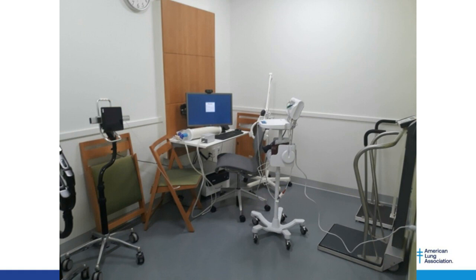I want you to notice how close the two chairs are next to each other. We have the calibration syringe and a spirometer on the table there, along with all the other kinds of things that we use for intake. This is the old days, right, before COVID. This is where we used to do the spirometry fairly routinely, especially in our primary care centers.